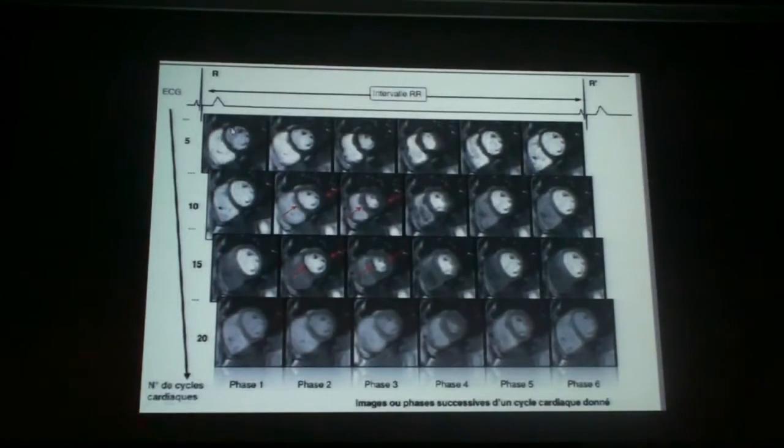Imagine this slice that goes along time. First you have an enhancement of the right ventricle, then left ventricle, then your myocardium, and then you get a bit further away with decrease of the gadolinium in your heart. And this is diastole. You get no artifacts in your wall. You can see it's perfectly enhanced everywhere on the anterior, lateral, inferior, and septal wall.